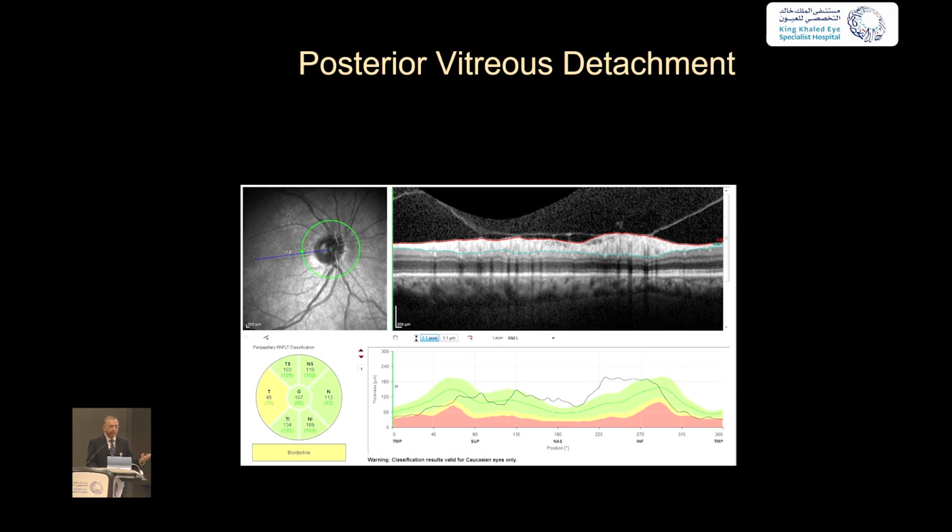Because I still haven't understood the role of the vitreous. It's only there to create mischief, right? Causes tears, detachments, messes up the OCT. And I don't know why, when they did decide how to look at the nerve fiber layer, they put a circle scan just in the same area where the vitreous is attached. The 3.4 millimeter scan is the exact diameter of the Weiss ring.